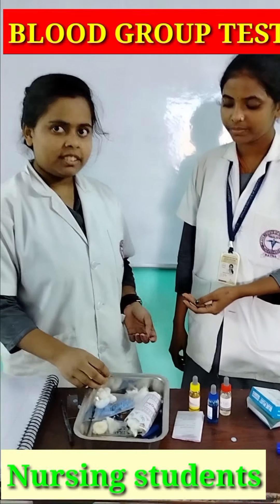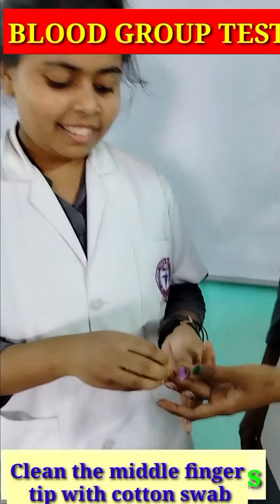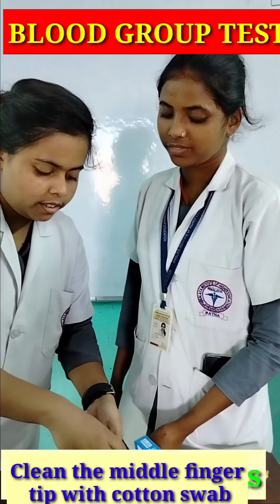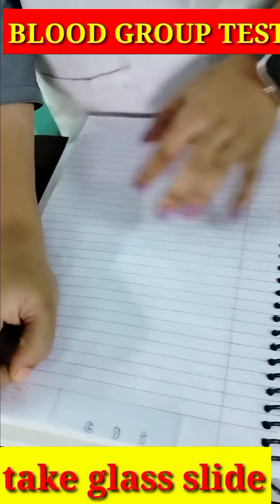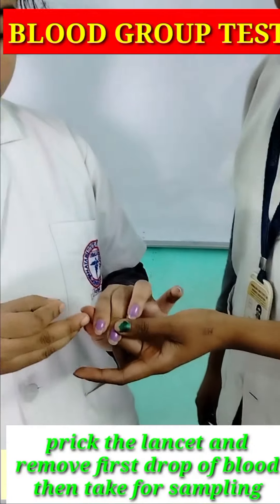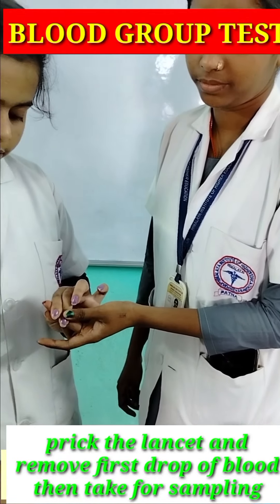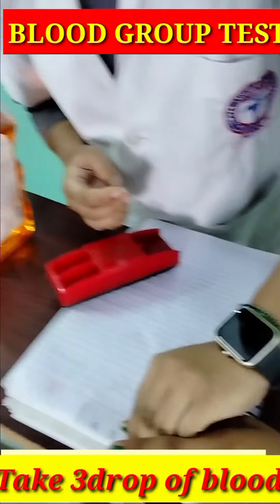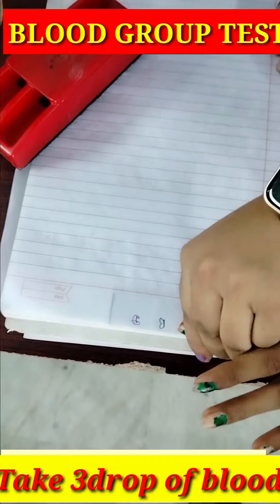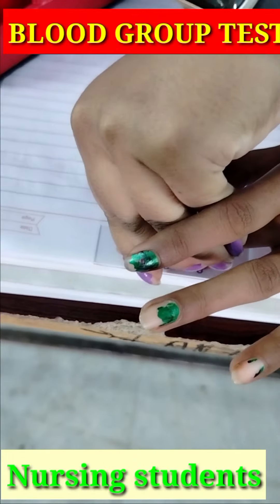So today we are showing you blood grouping. I am going to show you my batch mates.